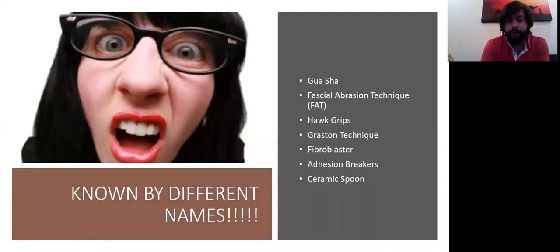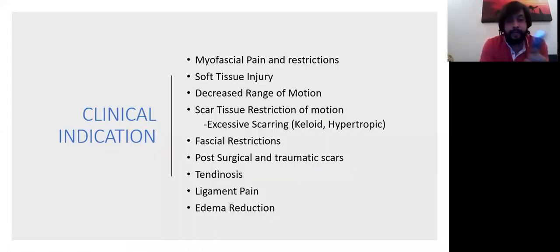Yeah, so this I already explained to you. There are different names for this technique, but basically it is called IASTM because you are using an instrument to release myofascial structures. Now, what are the clinical indications for IASTM?